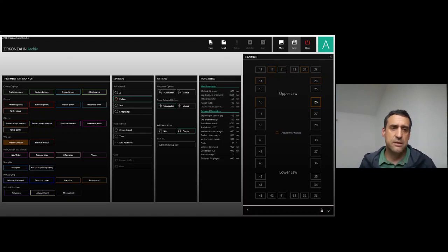In this case, just to make the components clearer for you, I prepared two different models, one with the multi-unit abutment and one without any multi-unit abutment with the overstructure, and I milled it, so you can also see from the picture how these kinds of restorations turn out.